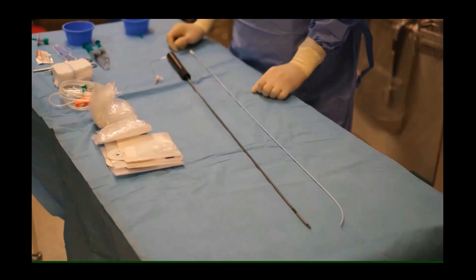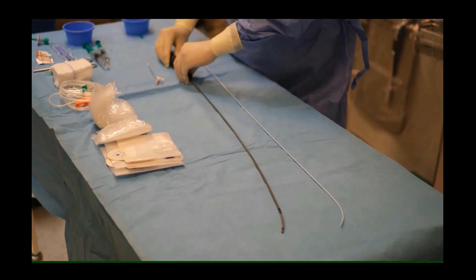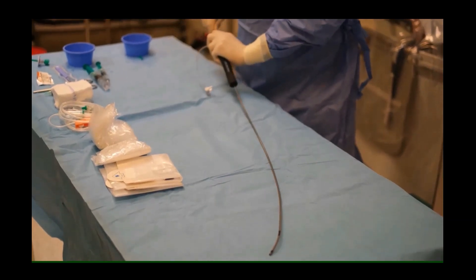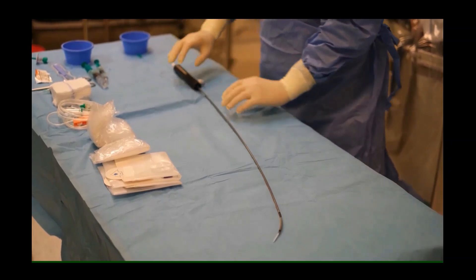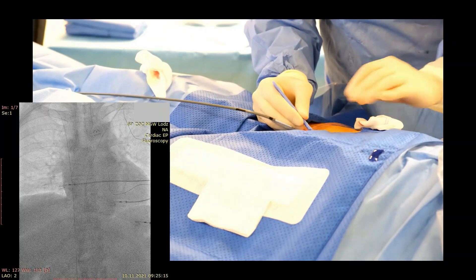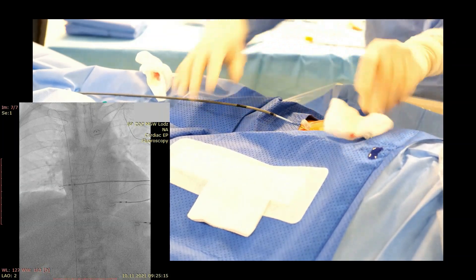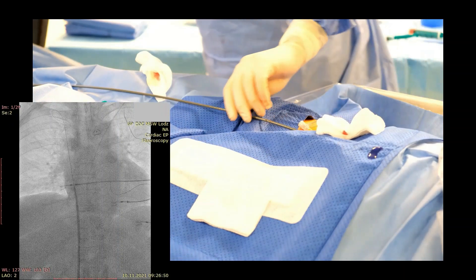Now I will guide you step by step through the transeptal puncture carried out directly with the steerable sheath. Prepare the sheath, bend it a little bit and introduce the dilator, aligning the curve of the dilator with the curve of the sheath. Puncture the femoral vein as usual and introduce the long wire into the SVC. Then introduce the sheath over the wire.